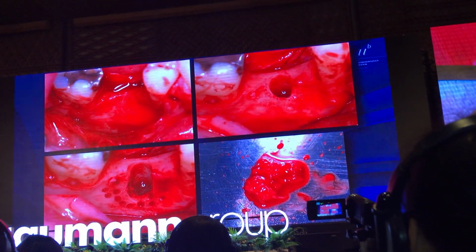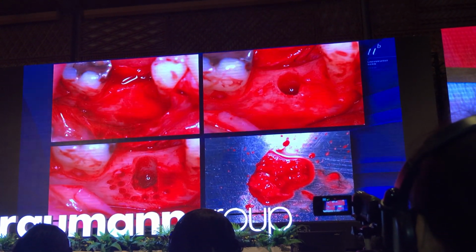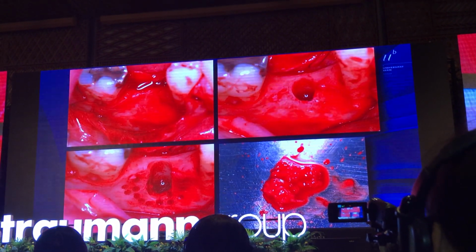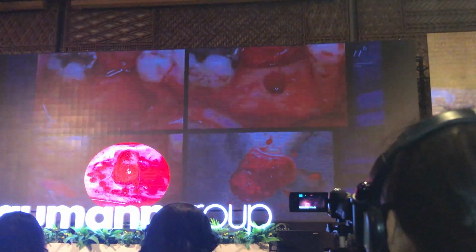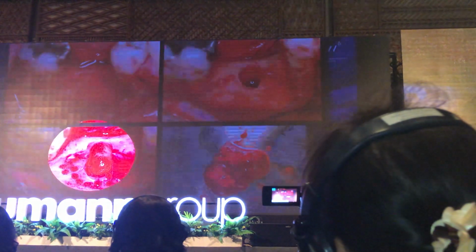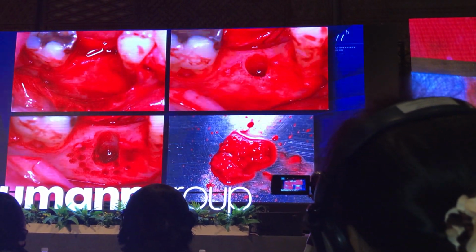Then you get a lot of osteoclastic activity to get rid of that bone. You don't want osteoclasts in your site, you want osteoblasts. So I take it off and create a balcony, as you can see.